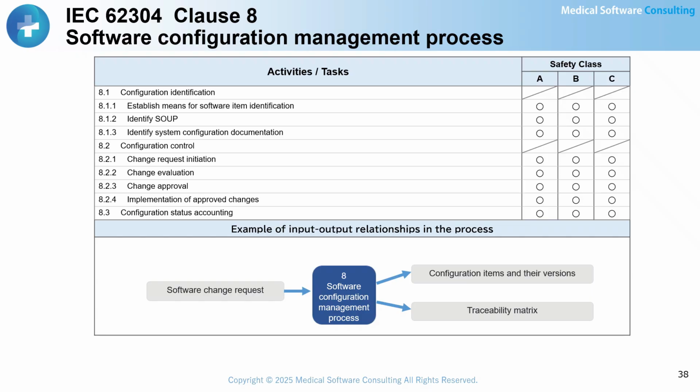To carry out effective configuration and change management, it is practically necessary to introduce configuration management tools and change management tools. However, simply installing tools is not enough. Organizations must also establish documented procedures for configuration and change management, provide training for staff, and monitor whether the processes are being followed correctly.